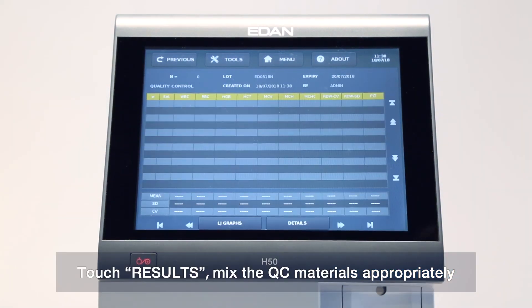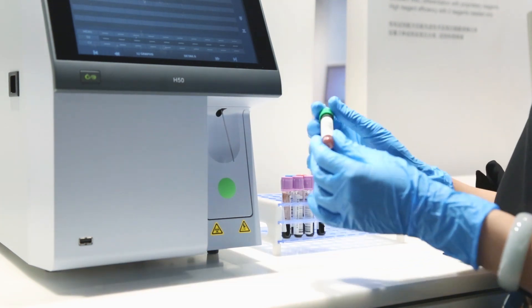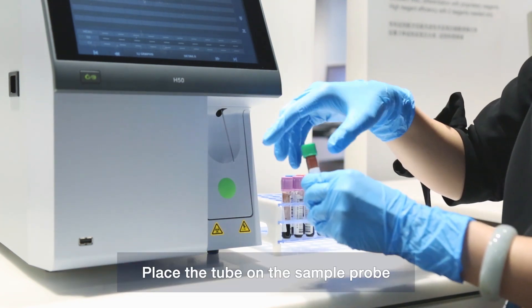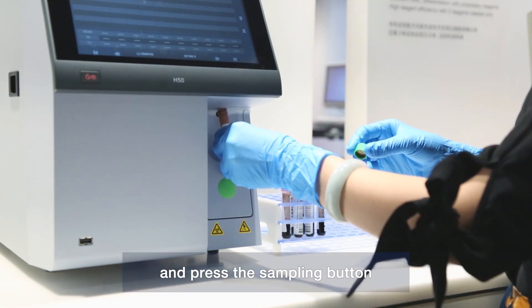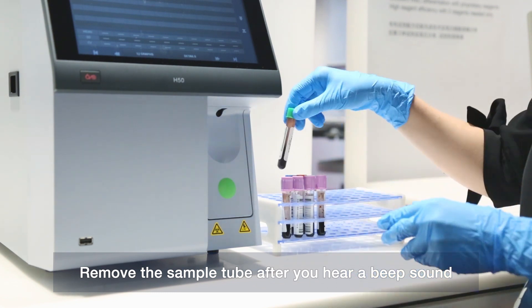Touch Results. Mix the QC materials appropriately. Place the tube on the sample probe and press the sampling button. Remove the sample tube after you hear a beep sound.